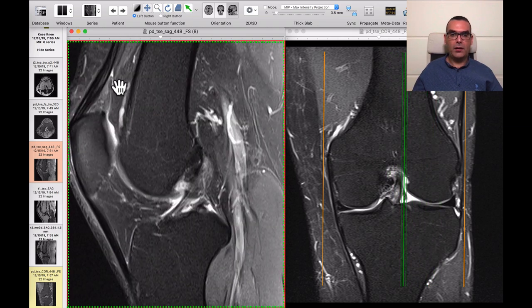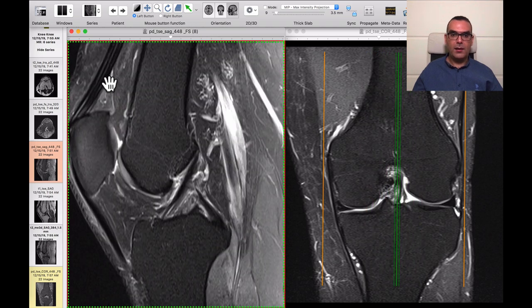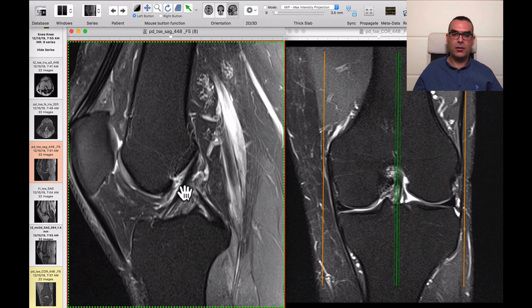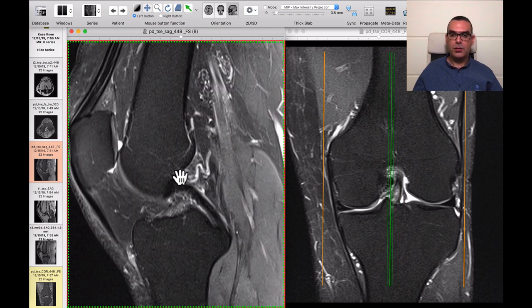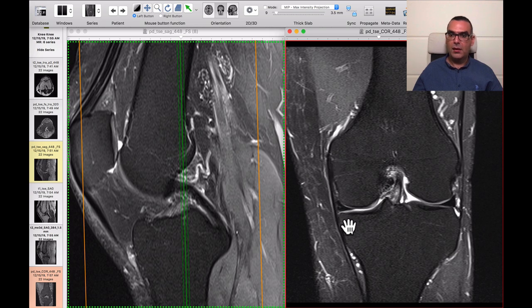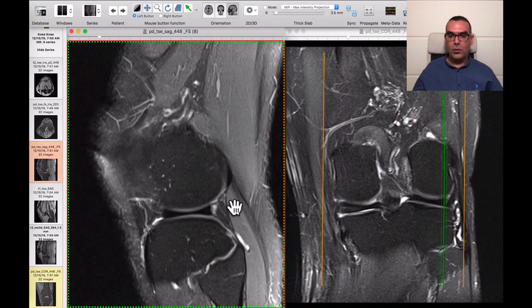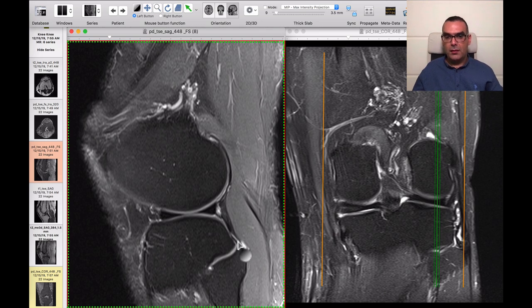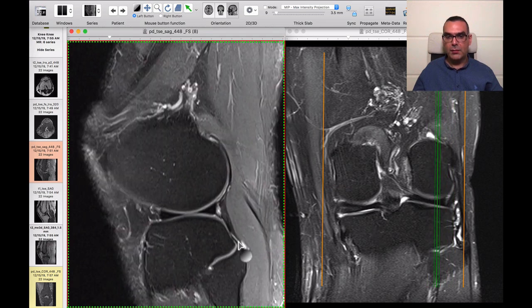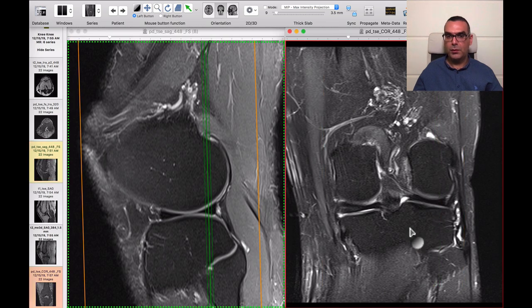The amount of joint effusion is minimal. The suprapatellar fat pad and Hoffa's fat pad are intact. The ACL is homogeneously hypointense from the femoral to the tibial attachment. The posterior cruciate ligament is also intact. On the coronal scan, the medial collateral ligament is normal, the lateral collateral ligament is normal, and we can see the arcuate ligament and popliteus tendon. There is also the popliteofibular ligament — the posterolateral corner structures are intact.